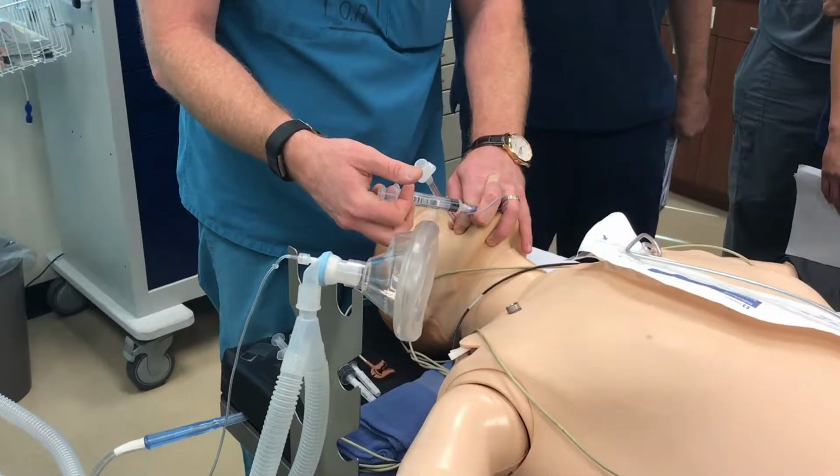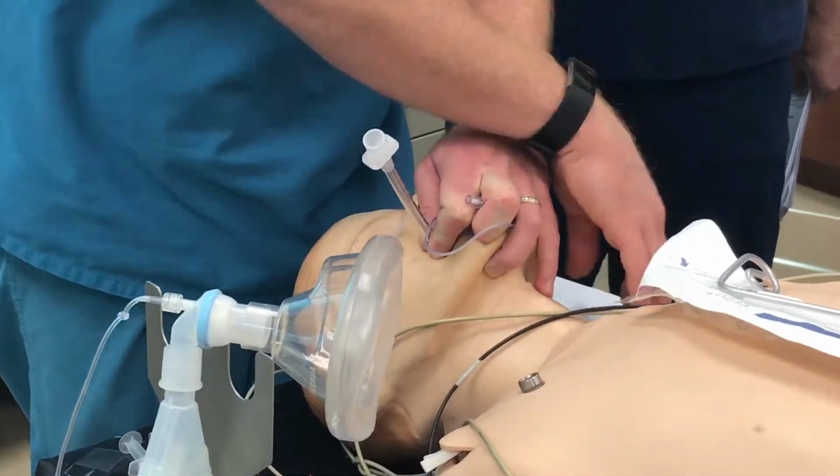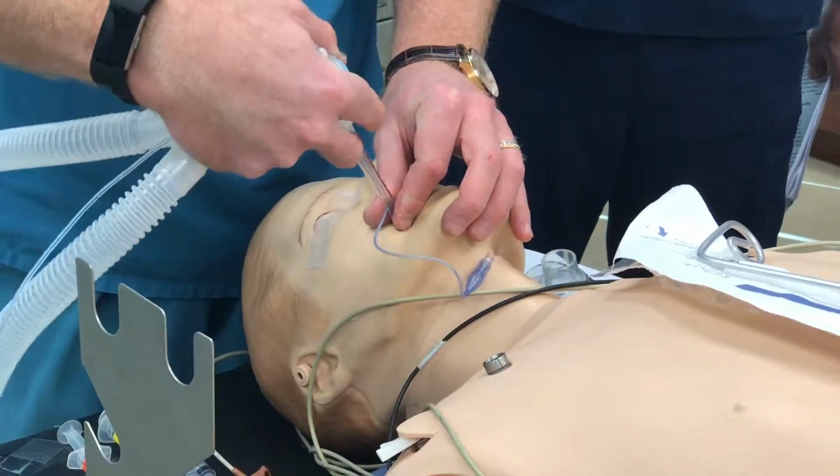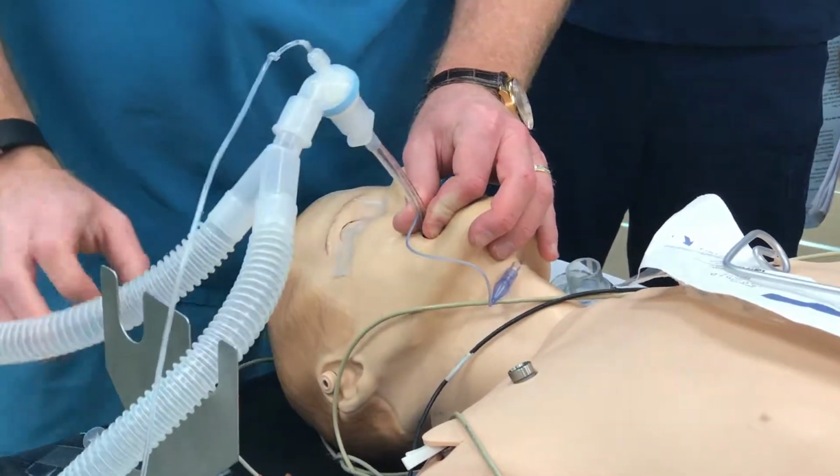Inflate the cuff, let it come out as much as it can. That pressure is going to re-inflate. That's fine there now. You just heard him go asystole. You have sinus pause. We're still okay. That was a joke, I guess.